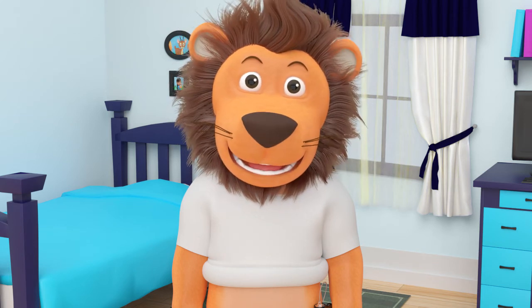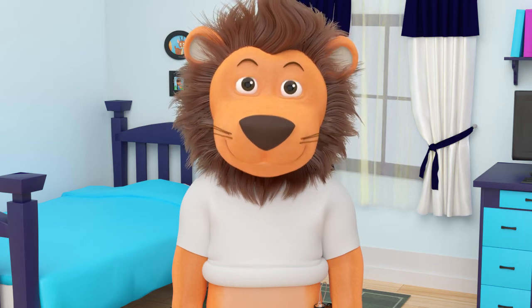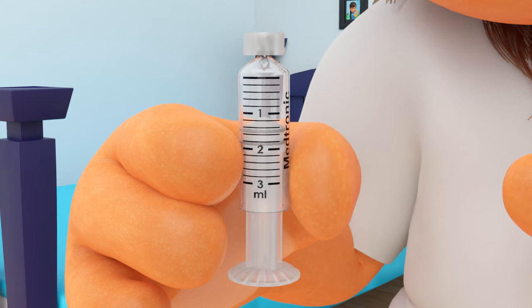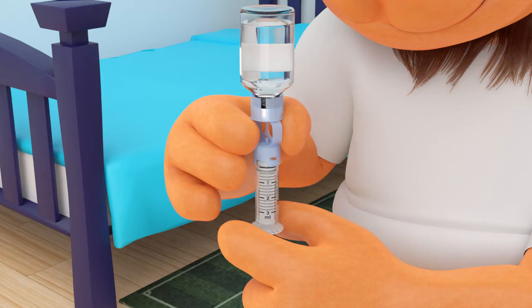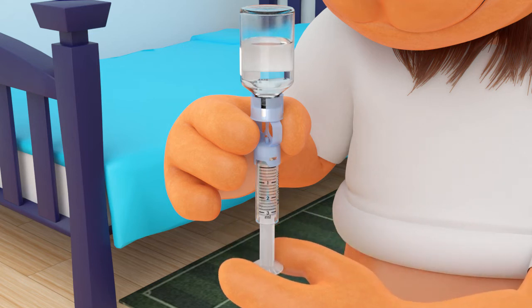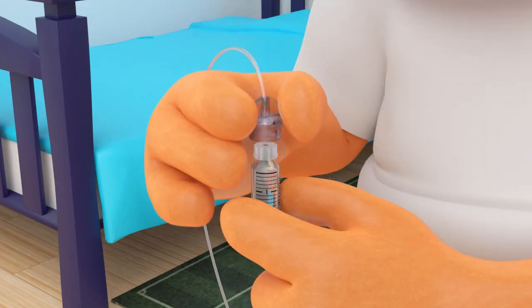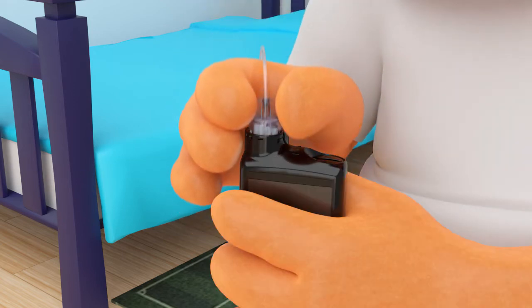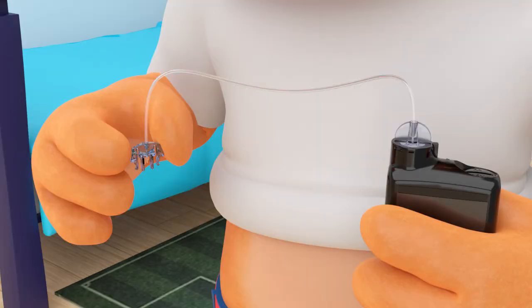The first thing we need to do is fill up with new insulin using a reservoir. The reservoir looks like this. The reservoir holds the insulin in the pump and connects to the infusion set. Fill the reservoir up with insulin. Next, you'll need to connect the reservoir to the infusion set. Put the reservoir in the pump.